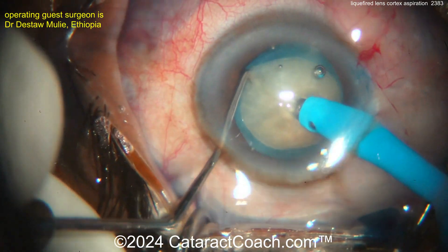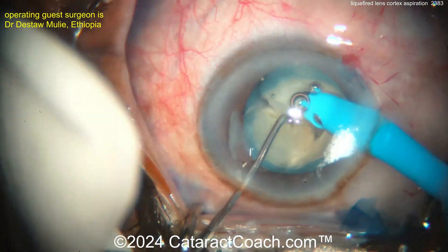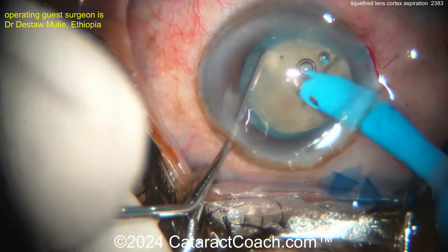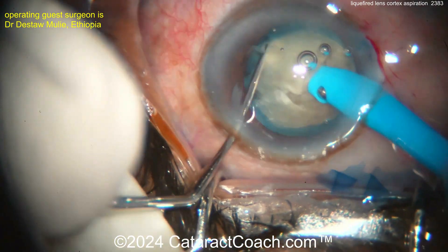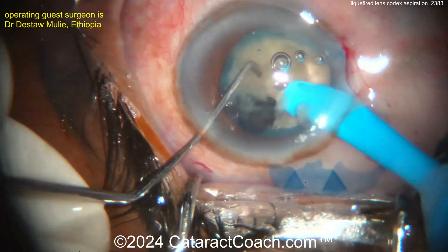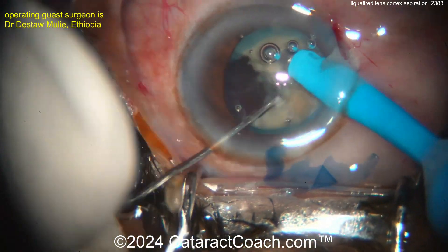Now let's see the technique: phaco probe buzzing in, chopper going around — nice chop technique, rotating again. We've obviously sped the video up to be efficient, but beautiful technique with very efficient movements. Nuclear pieces being aspirated very easily.